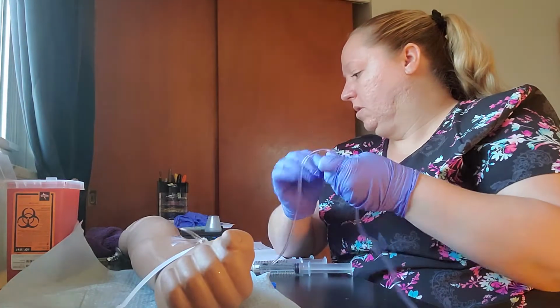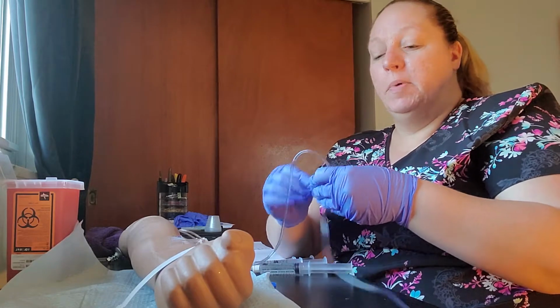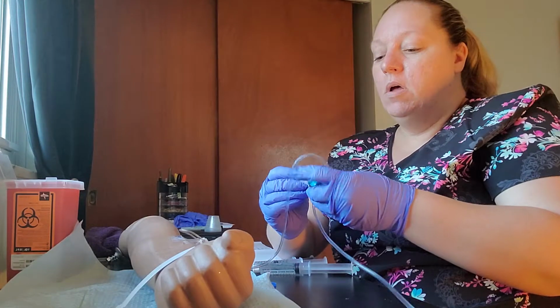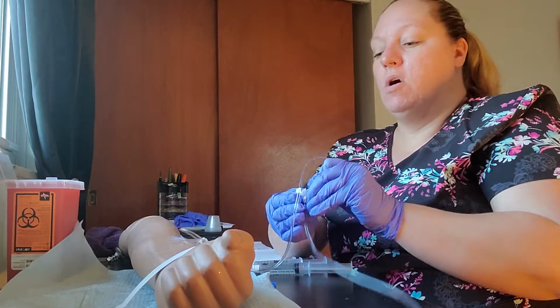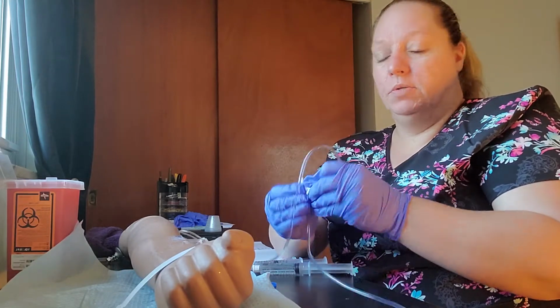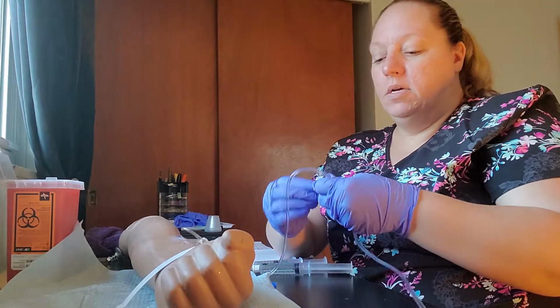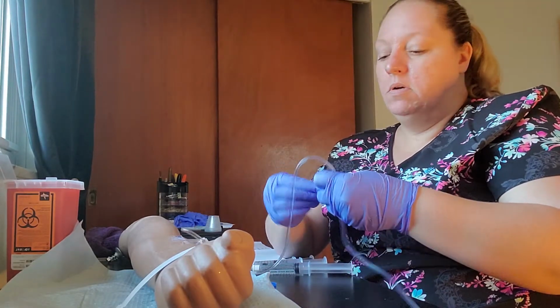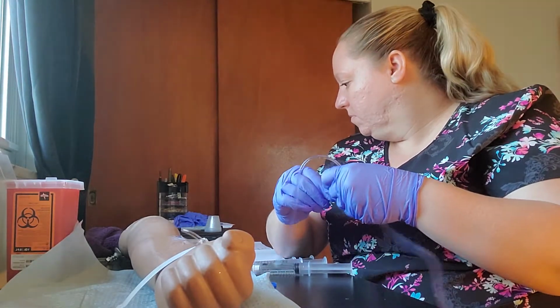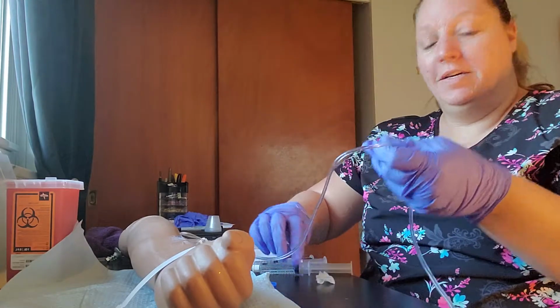This is a good time to explain why we clean the port. We clean this port because we don't want to introduce any infection, any kind of microorganisms or anything harmful into this tubing while giving this IV push. It's very easy to introduce pathogens into the line and then into the bloodstream. Okay, that's good and clean.